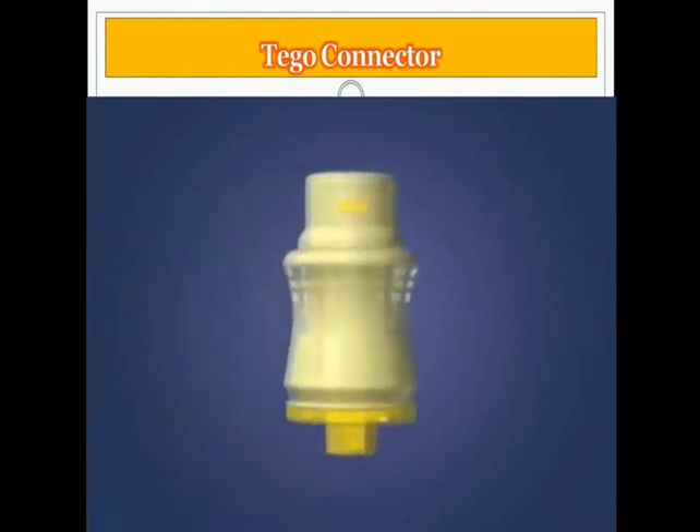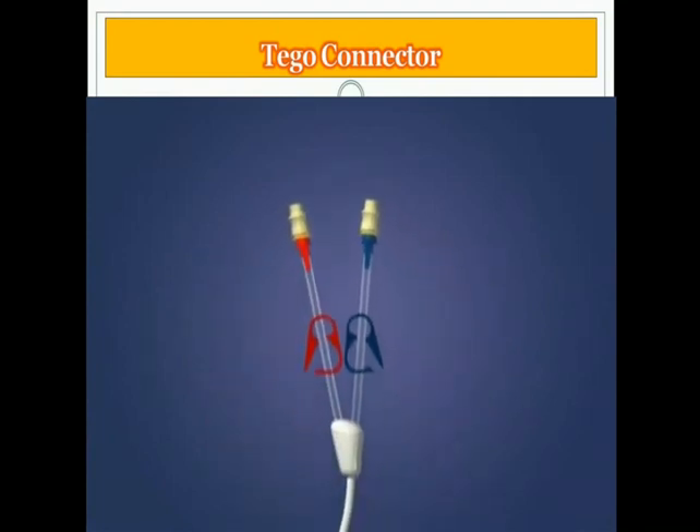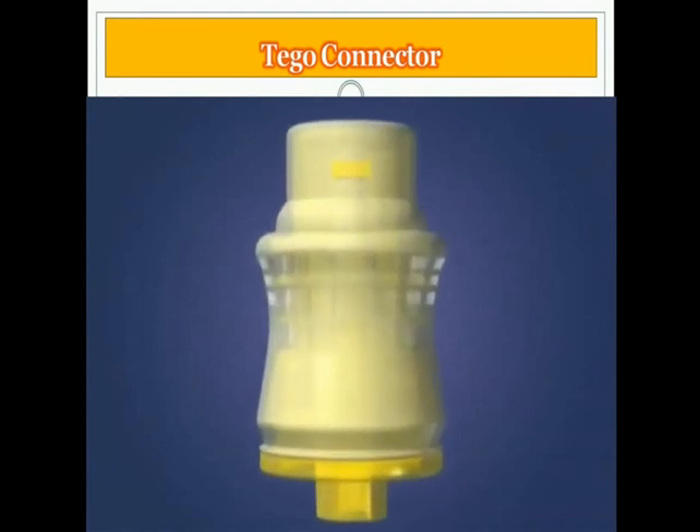The TAGO connector is the only catheter protection device available today specifically designed for hemodialysis catheters. The ability of the TAGO to prevent contamination of the catheter while performing the hemodialysis treatment is demonstrated in this model.